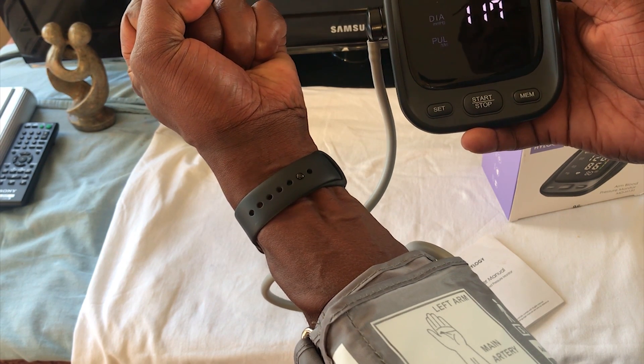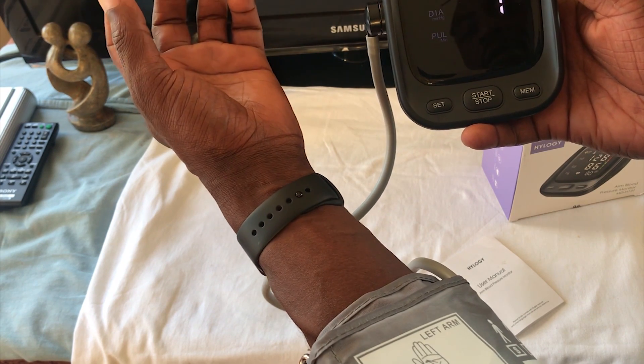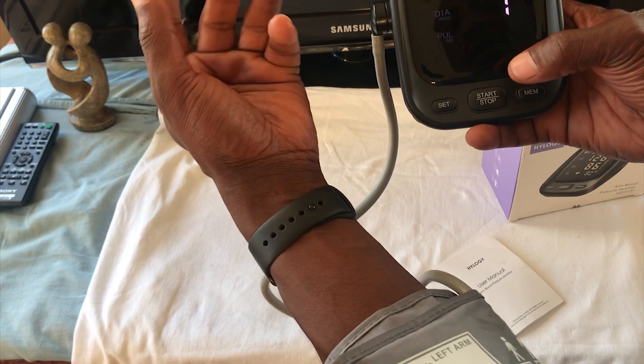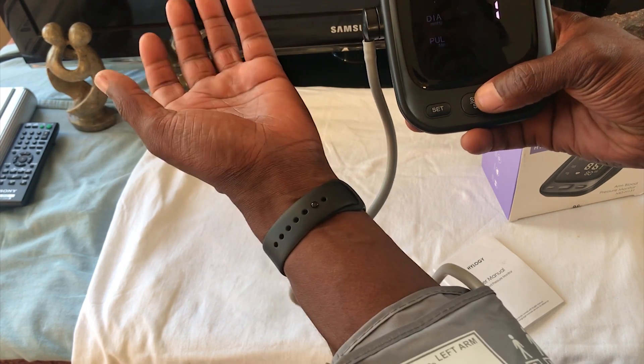This will obviously give you a false reading because I'm clenching my fist. Again, it recorded an error because I was actually moving my arm, so we'll start over.